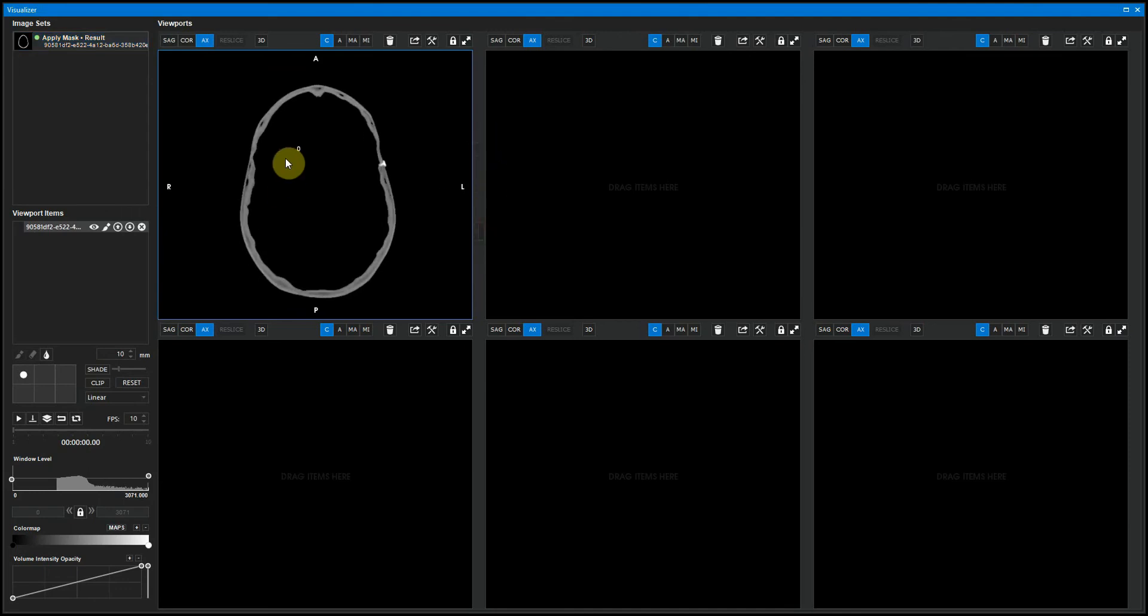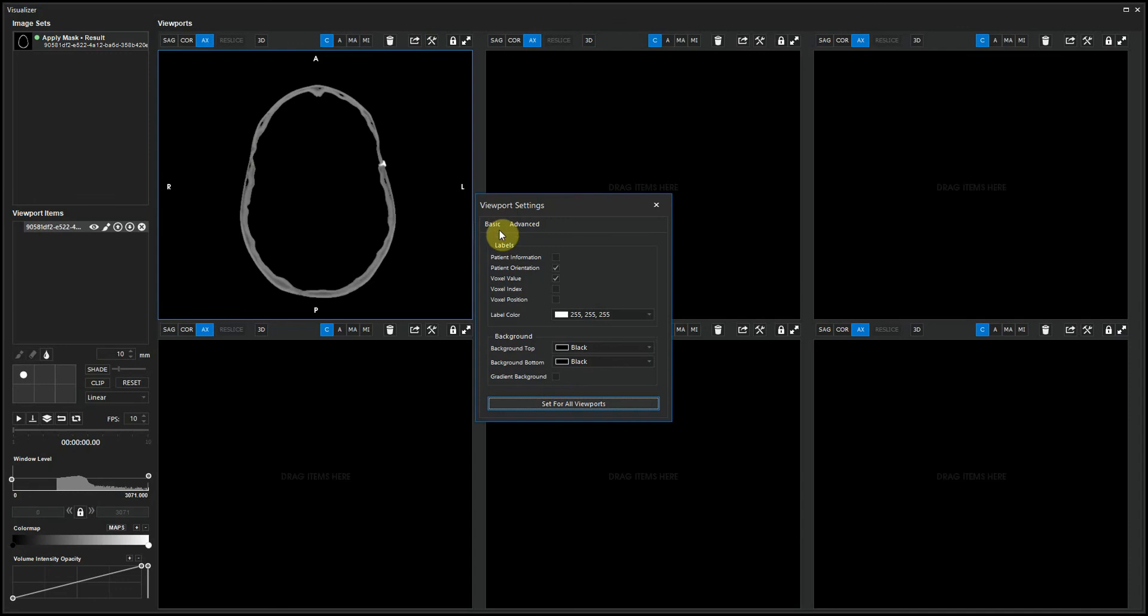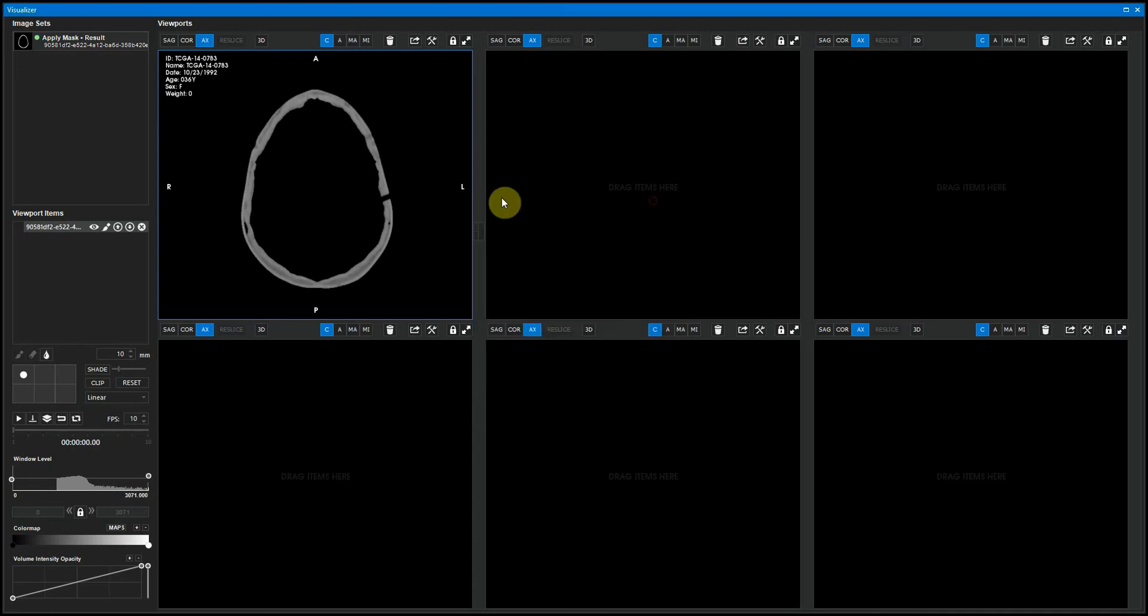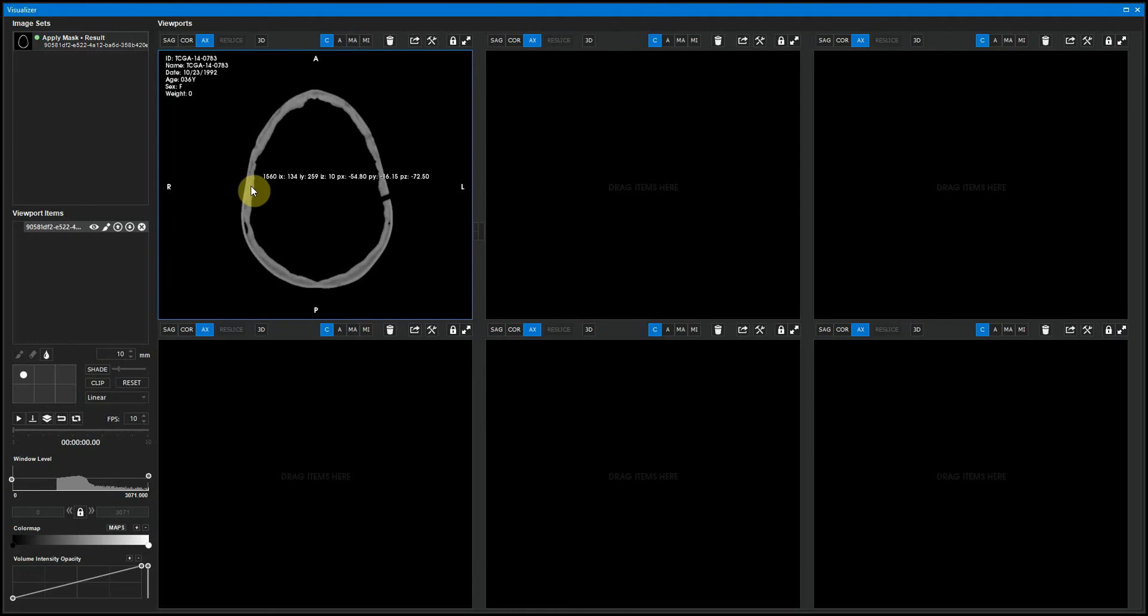The number that follows my cursor around is the value of the voxel under my cursor. I can change the information that's displayed by clicking the tool button. I can see the patient information. I can see the patient orientation. You can see the voxel value, also the voxel index and the voxel position. Now I have a lot of information following my cursor around. So I'm going to turn that off for now.